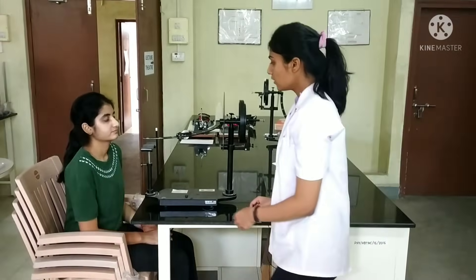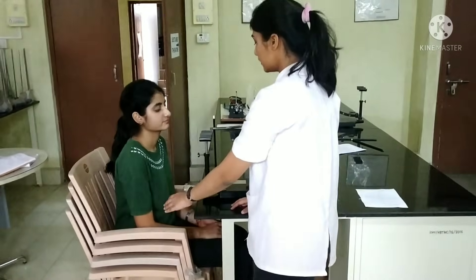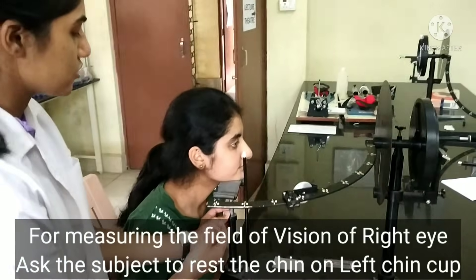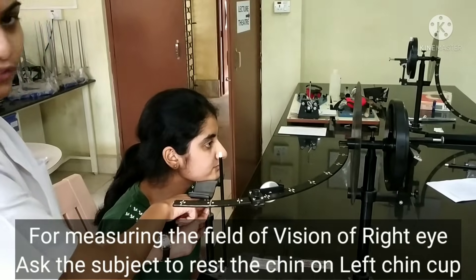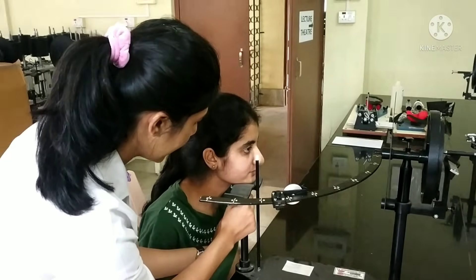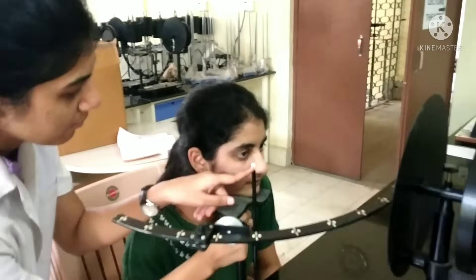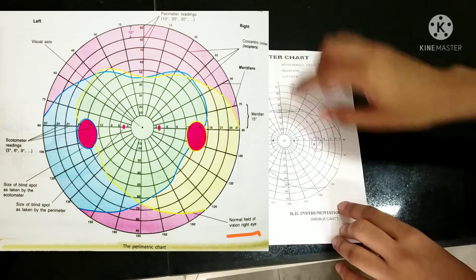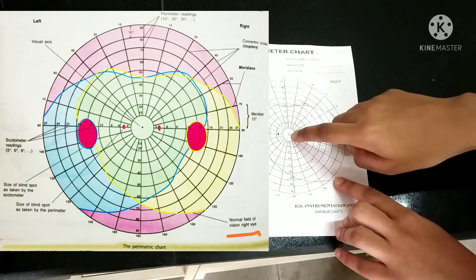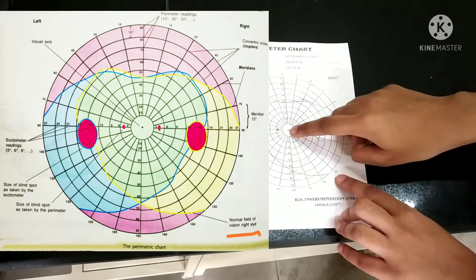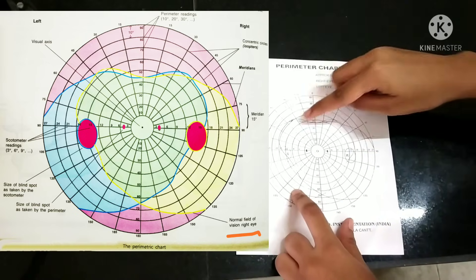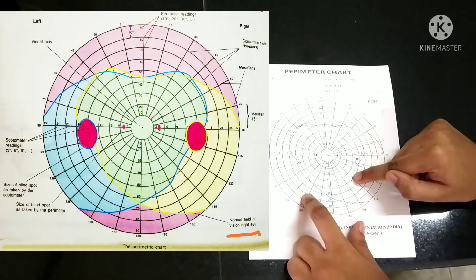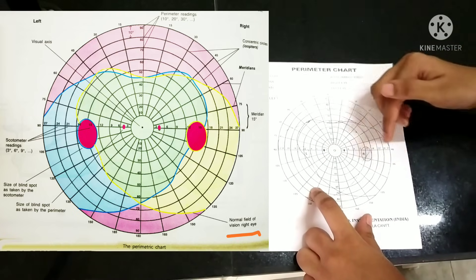Let us start with the procedure. I will ask my subject to sit comfortably on the chair. We will be measuring the field of vision for the right eye, so the subject keeps the chin on the left chin cup and we adjust the height so that the tip of the rod matches the lower eyelid. The perimetry chart has a central hole that corresponds to the visual axis of the eye. This is the visual field for the left eye, and this is the visual field for the right eye. The concentric circles are called isopters, present at an interval of 10 degrees each.